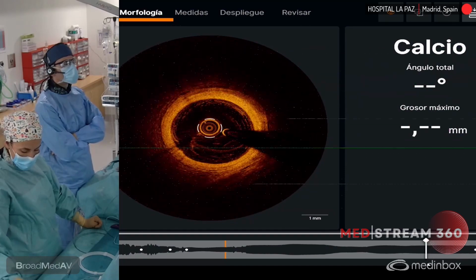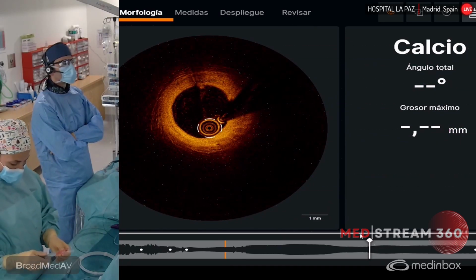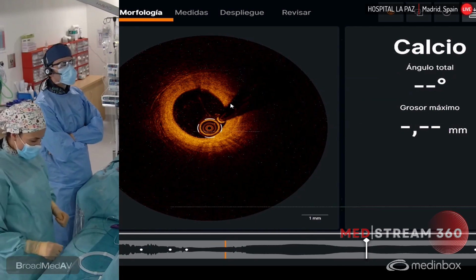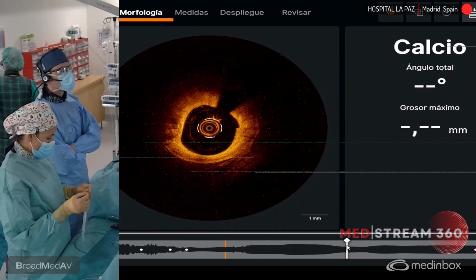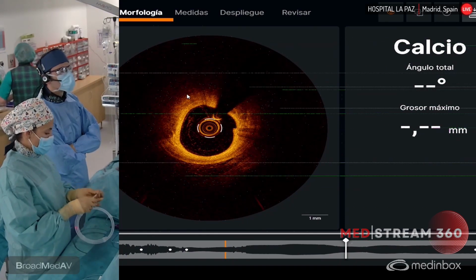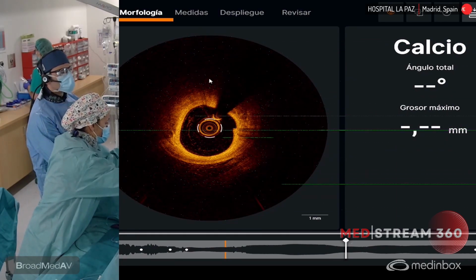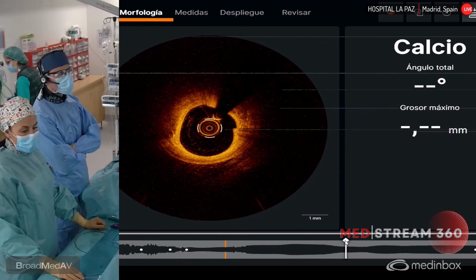This is the distal LAD that is a healthy vessel with the 3 layers. There is some fibrous plaque at this point. You can see the structure is uniform and highly brilliant, highly refractive image. No? And you can see here the image is changing. Now we can see a lipid pool in this part of the vessel. You can see that in this point the vessel wall is visible, but due to the high attenuation of the lipid tissue, we cannot see where the vessel wall is.